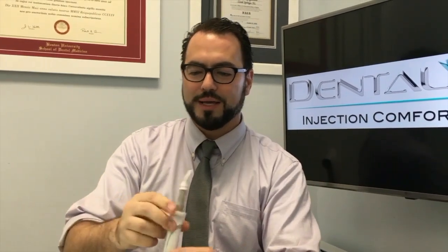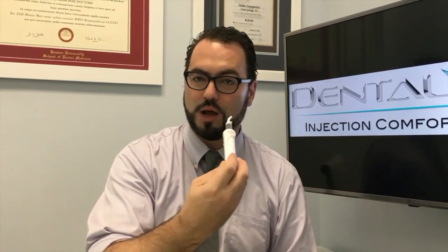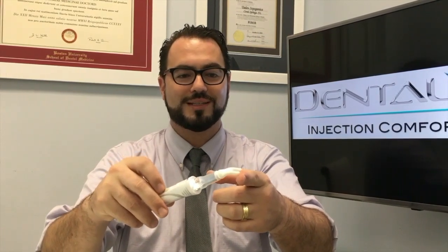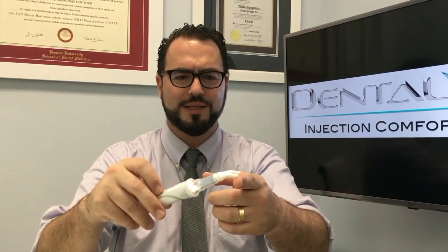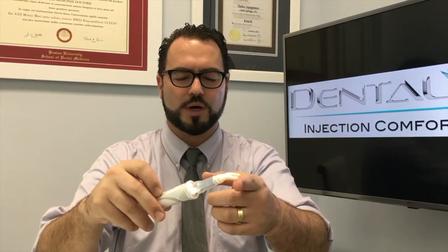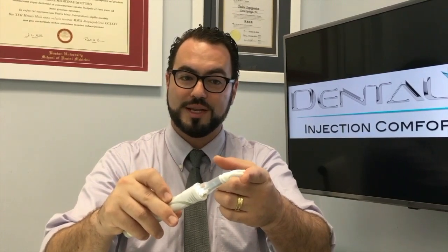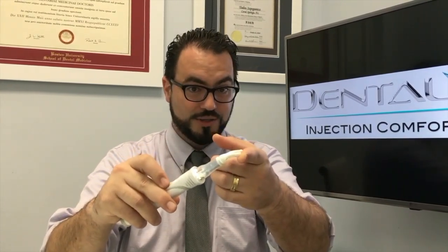So think about it this way: when you place a Dental Vibe and you want to give a little block, use the flexi tips to make it straighter so you can access the area. Apply it to the area where you're giving the mental block. Use the Dental Vibe with light pressure — the lightest pressure you place, the more it's going to vibrate on the area. If you touch it slightly, it's going to translate and transfer a lot of the vibration over to the area you're trying to numb. If you press hard, you get less vibration, and if you press even harder, it stops.